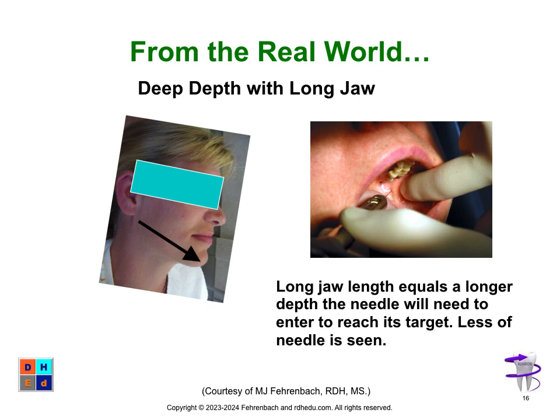So let's look at that. Here's our long jaw, and again, here's our depth over on the right side here. You can see it's amazing. So again, add this to your repertoire: deep depth, long jaw, less of the needle is seen.